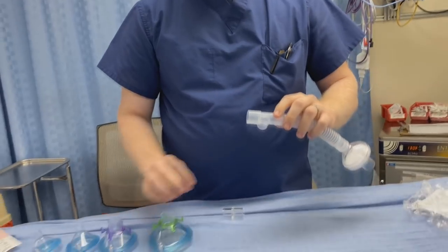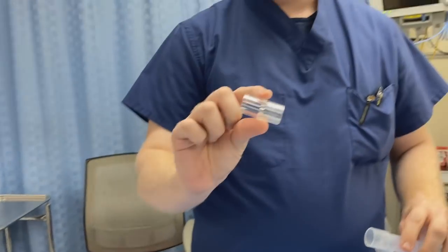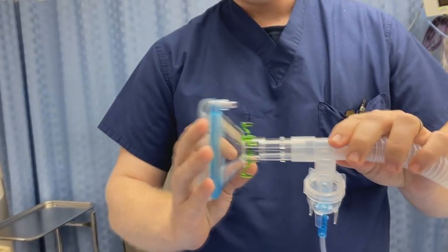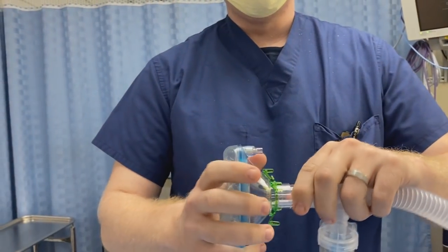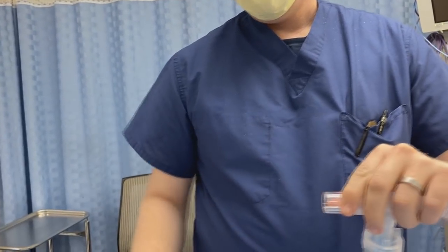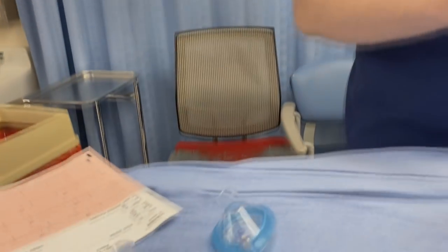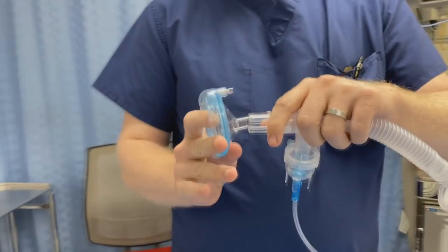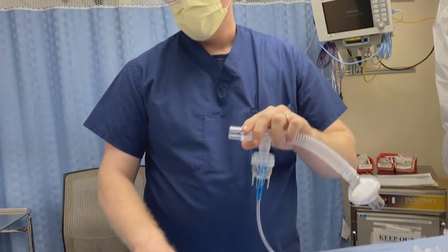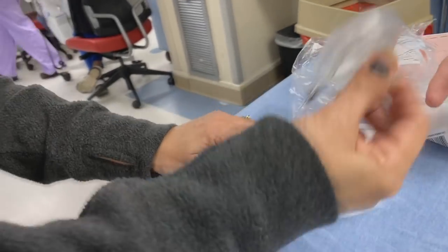Our respiratory therapist was wonderful and said 'this is what you need,' and he got these connectors that fit into that mouthpiece. Now you can assemble the entire thing. Incidentally, they also fit the next size down as well as the neonatal sizes — so we found a solution that lets us use the entire spectrum.